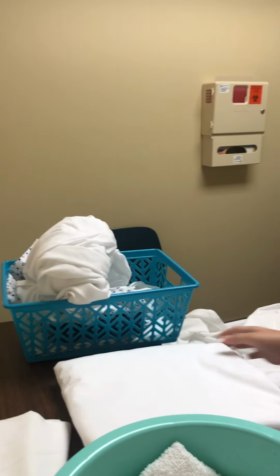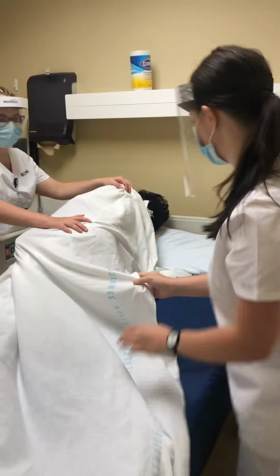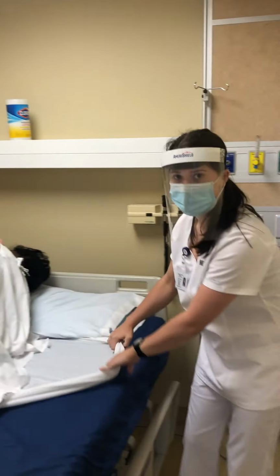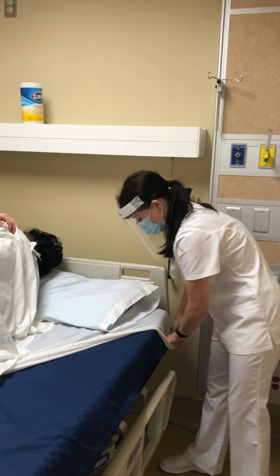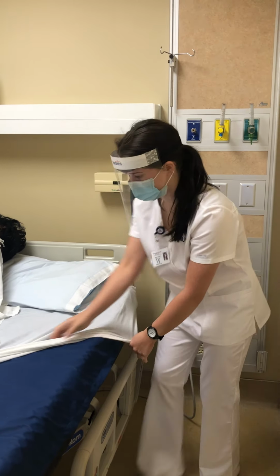Today I'm just going to lay. I'm going to pull the rest of the clean bed linen over this side of the bed, again keeping it as tight as possible.